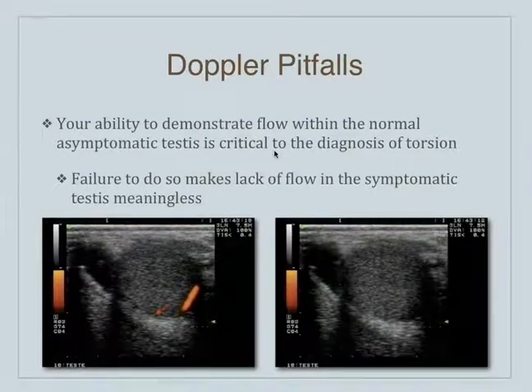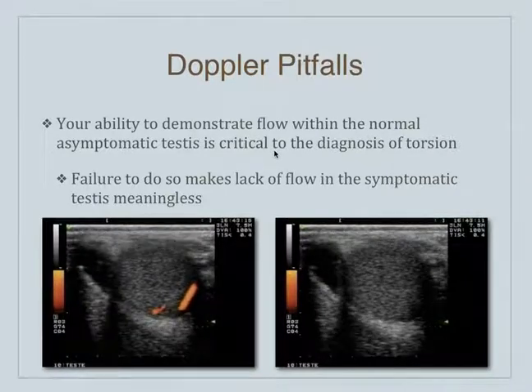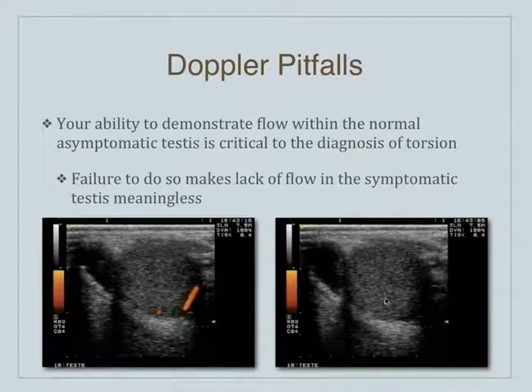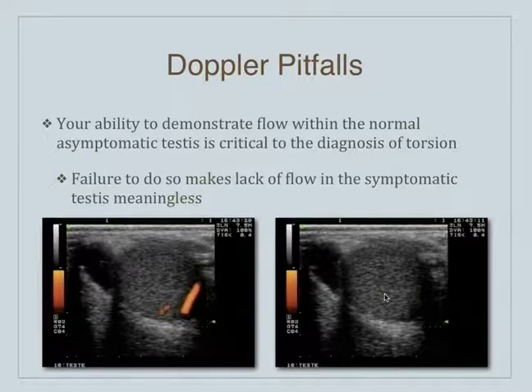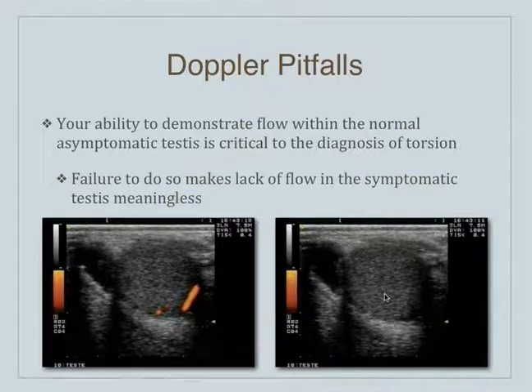You want to demonstrate flow to the asymptomatic testes and then, using those same Doppler settings, bring it over. This is the asymptomatic side, and this is the symptomatic side on this patient. Otherwise, you really can't make a lot of conclusions about the symptomatic side.